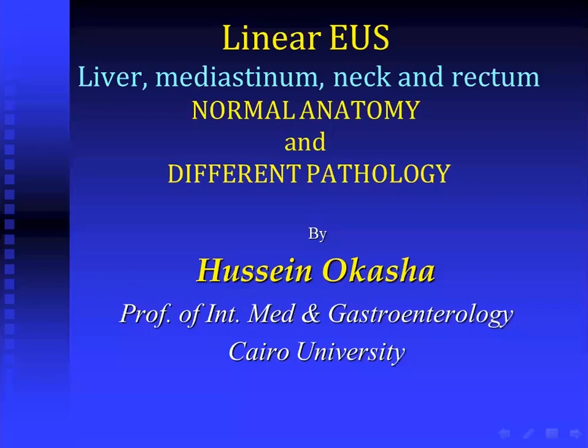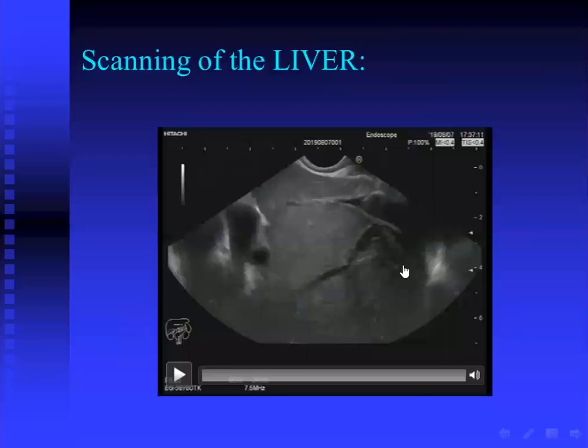In less than 1 hour, we will start with liver examination. Now, to start the liver examination, our landmark, as I mentioned in the first webinar, is the inferior vena cava, the uppermost part of the inferior vena cava at the right crus of the diaphragm.